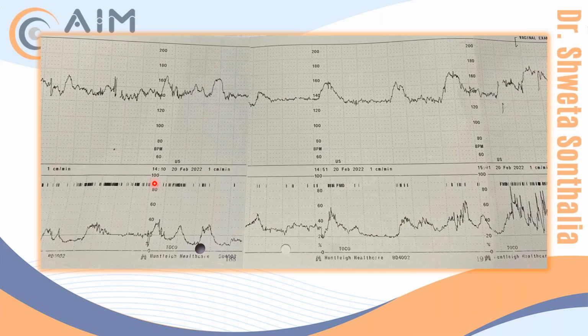And I can see only accelerations? Okay, no decelerations. Very good, perfectly right. So what kind of CTG is this? This is a normal CTG, I guess. Very good. No, not guess. You should be confident by now, because you can't see anything abnormal in this, and such a big acceleration. So you're very happy.